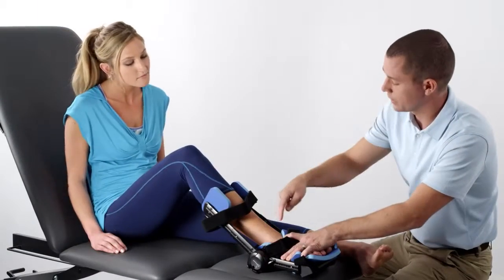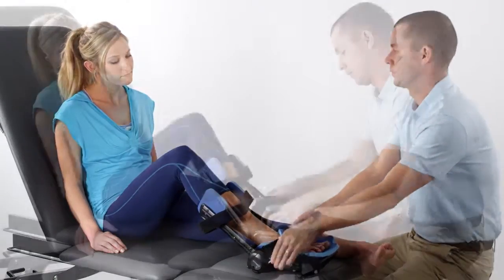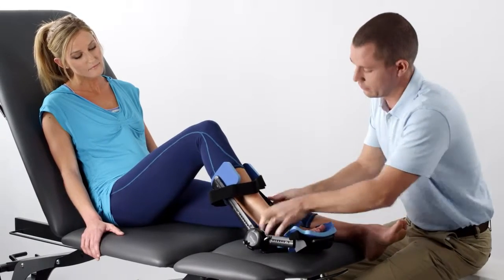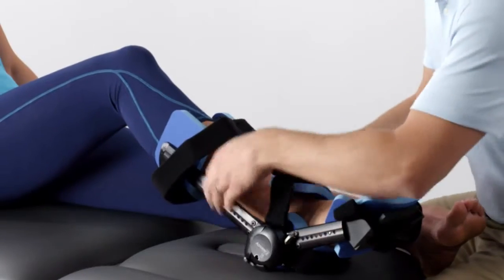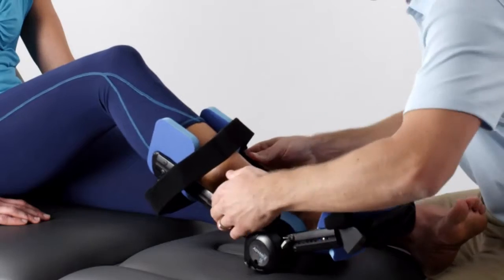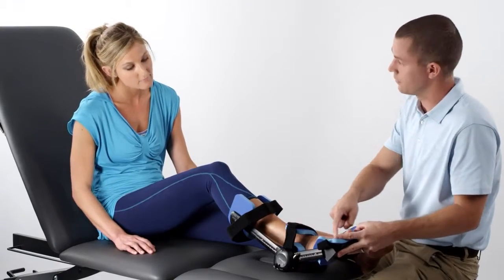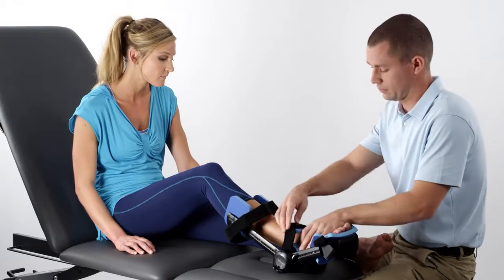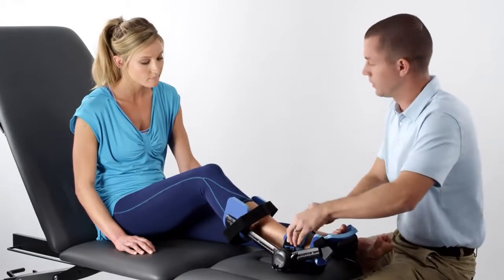Line up the tension springs with the medial and lateral malleoli. Palpation may be required to properly position the tension springs. Align the proximal struts with the long bones of the calf, both medially and laterally. Position the ball of the foot on the midpoint of the foot cradle. Then secure the heel cradle straps to maintain proper foot position.